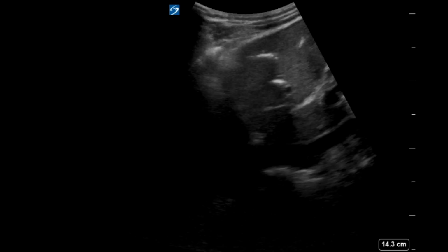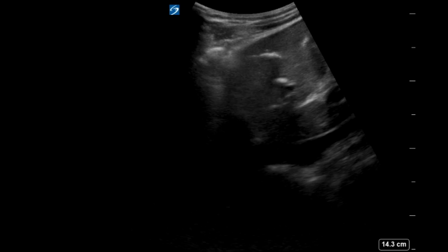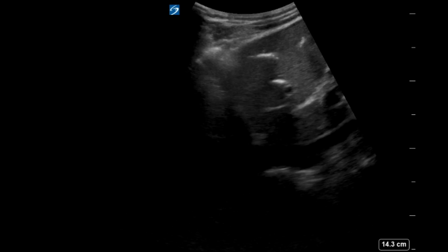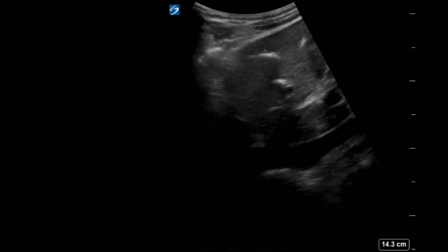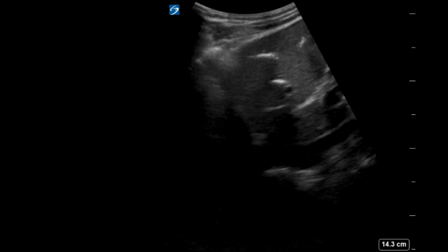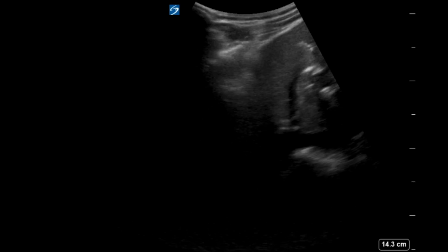So this is a middle-aged man who came to the hospital, had a history of chronic pancreatitis, and had a history of a pseudocyst. At one point, he underwent a hepaticojejunostomy and came in with epigastric and right upper quadrant pain. Okay. So it looks like they're doing a FAST exam here.